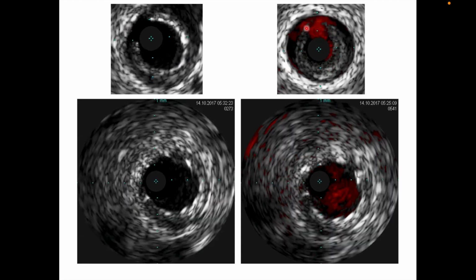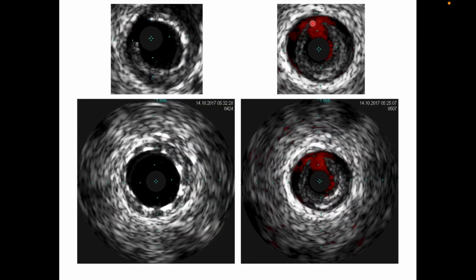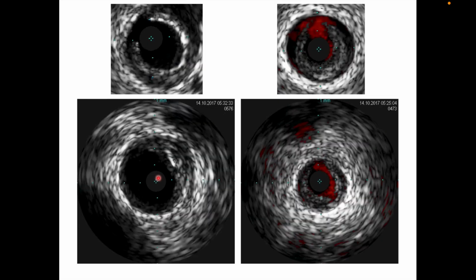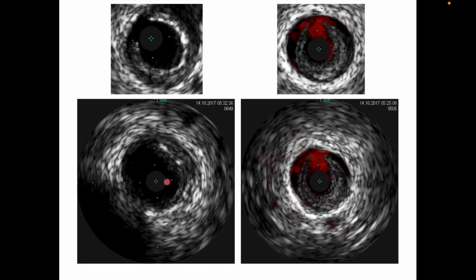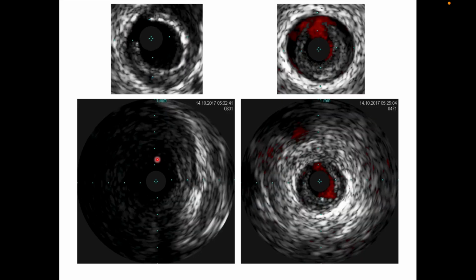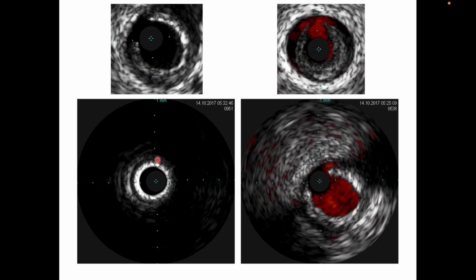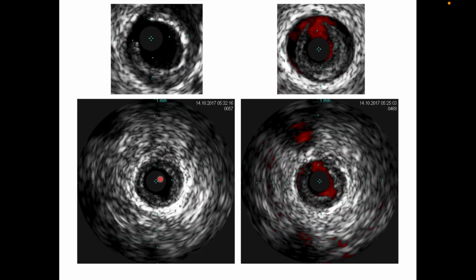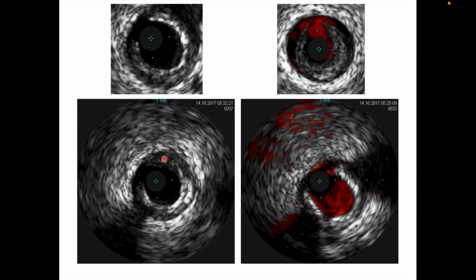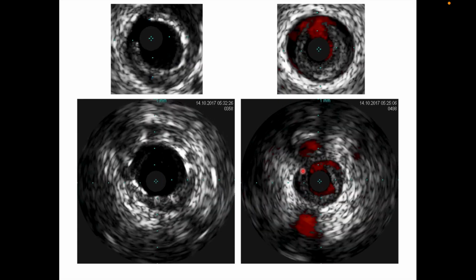That's the intimal break here, and that's the chromoflow going like this and going on the right and on the left. Now if you follow this again, you will see both the dissection flaps on both sides. And this is just in the aorta now. Once it starts running again, you will be able to see that. Okay, so now you'll be able to see the two dissection flaps. So keep looking here, and there you go. These are the two dissection flaps there, and this is the opening, and the same is shown here with the chromoflow going through it.